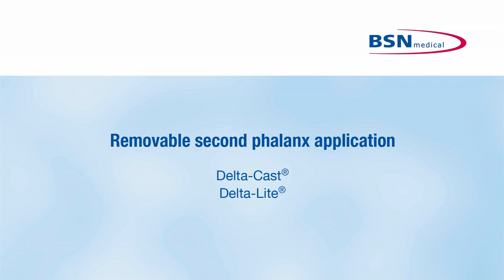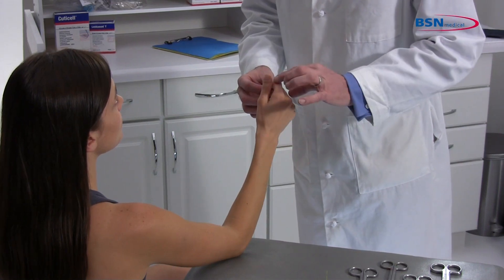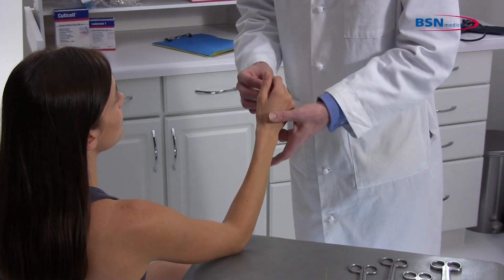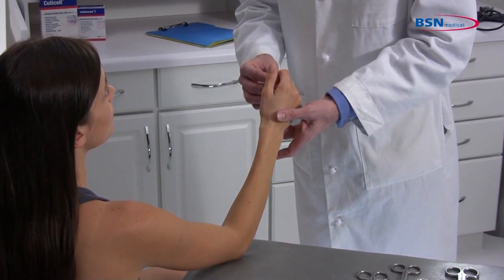Removable second phalanx application for indications where stabilization or support of the metacarpals and wrist joint are required. Follow physician's instructions on the proper positioning of the limb. A common position is with the wrist in slight dorsal flexion, neutral with regards to radial and ulnar deviation, and in slight supination.